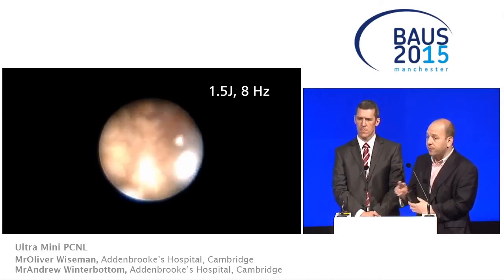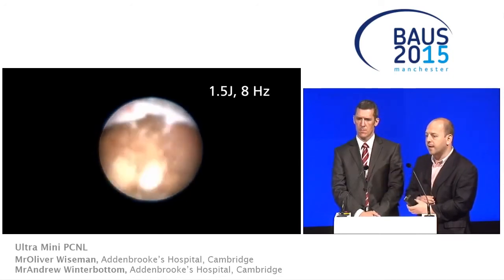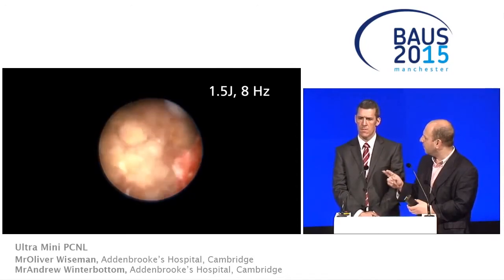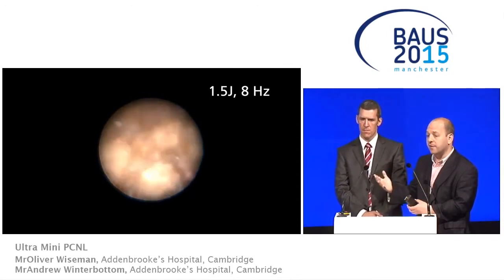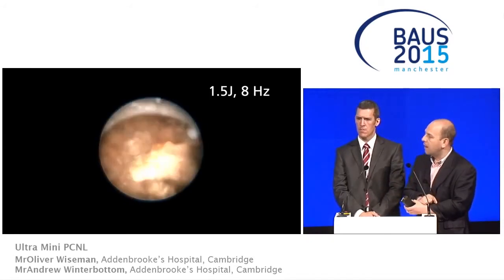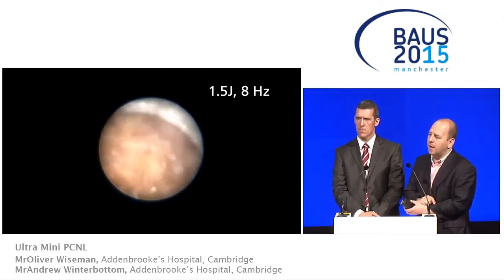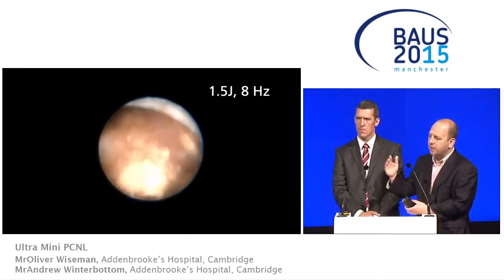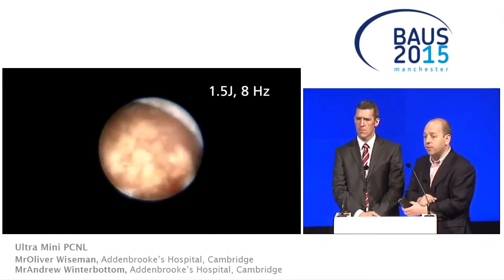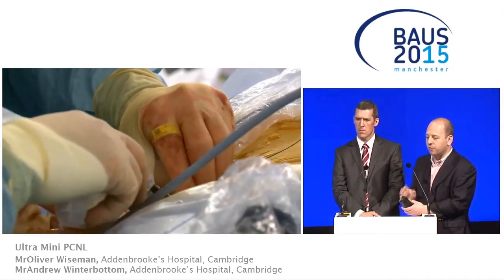So just to come to the 2-wire issue first, I don't think that this precludes a 2-wire technique. You can still have a wire on the outside, and in fact for our second 2 we did use a second wire on the outside so that we still got that security of having access back into the kidney. I was a bit concerned about the fragments flushing around the kidney, but in fact you can look into other calyces with this Ultra Mini kit. The calyces which we accessed using it didn't have any stone fragments in once we'd flushed all the fragments out.